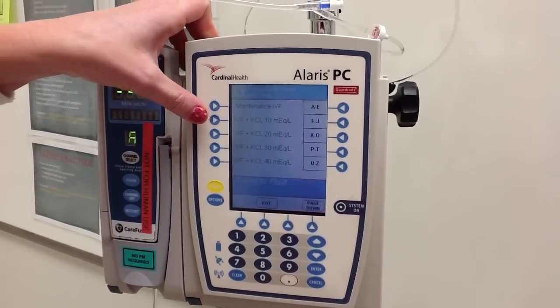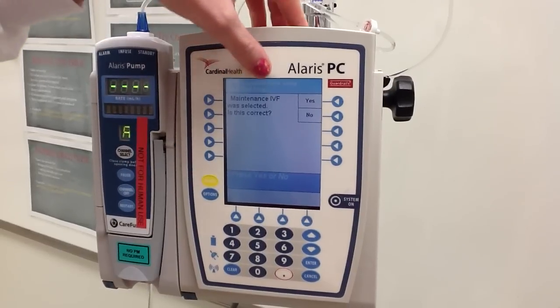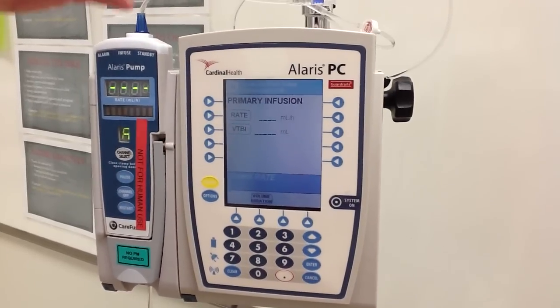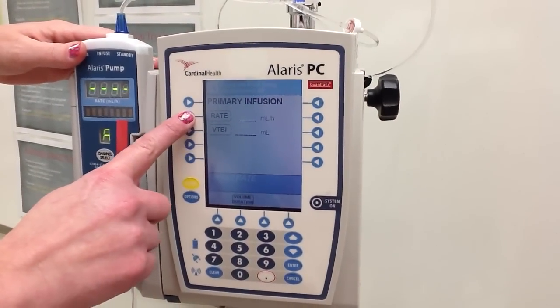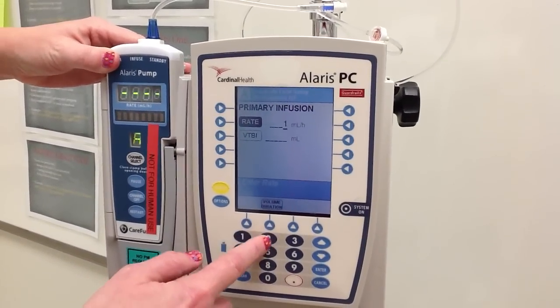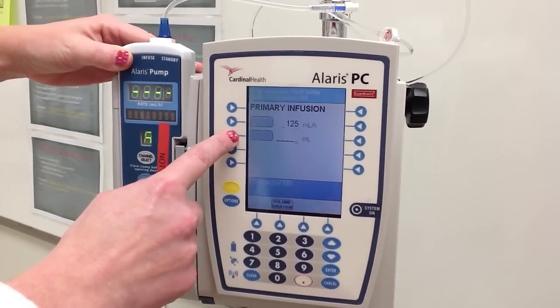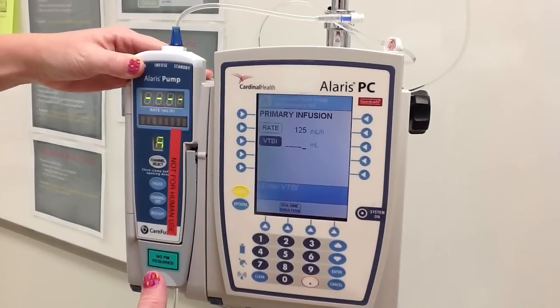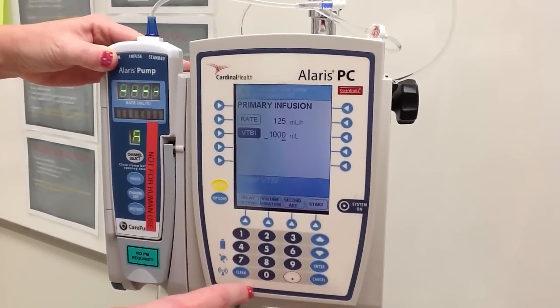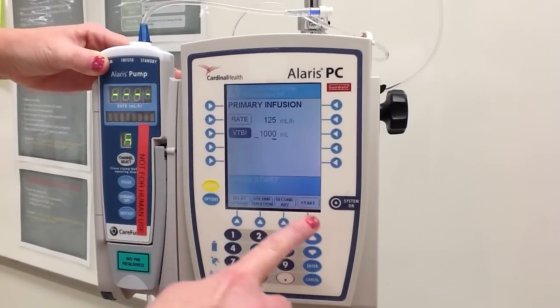We're just going to run a maintenance IV for this demonstration. It's going to say: maintenance IV fluids was selected — is this correct? Yes. If it wasn't, you would hit no and have the chance to reselect. I'm going to touch the button next to the rate and set my rate at 125, based on my doctor's order. Then I'm going to hit volume to be infused, which is the amount you want to be delivered, and enter that volume amount. It's going to ask: is this correct? I've confirmed it's correct.